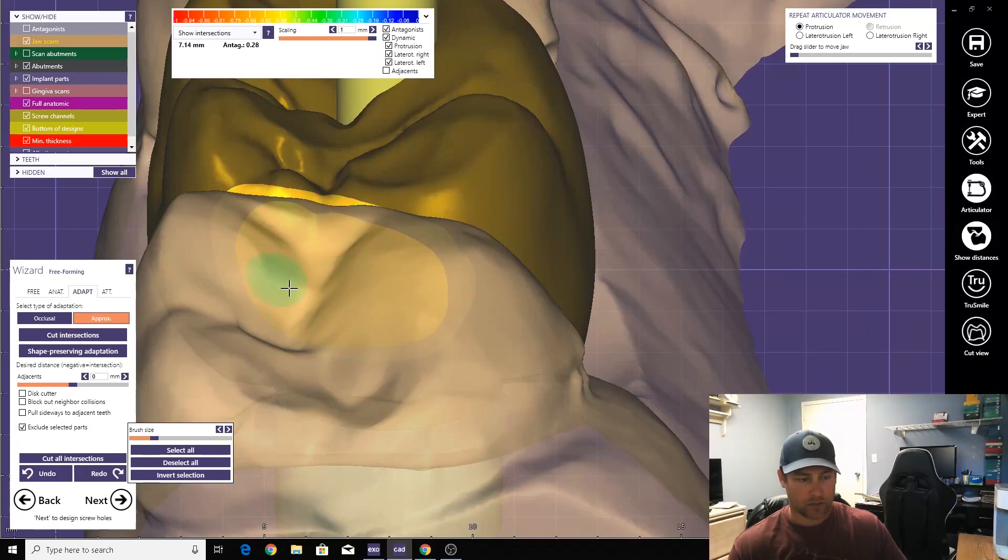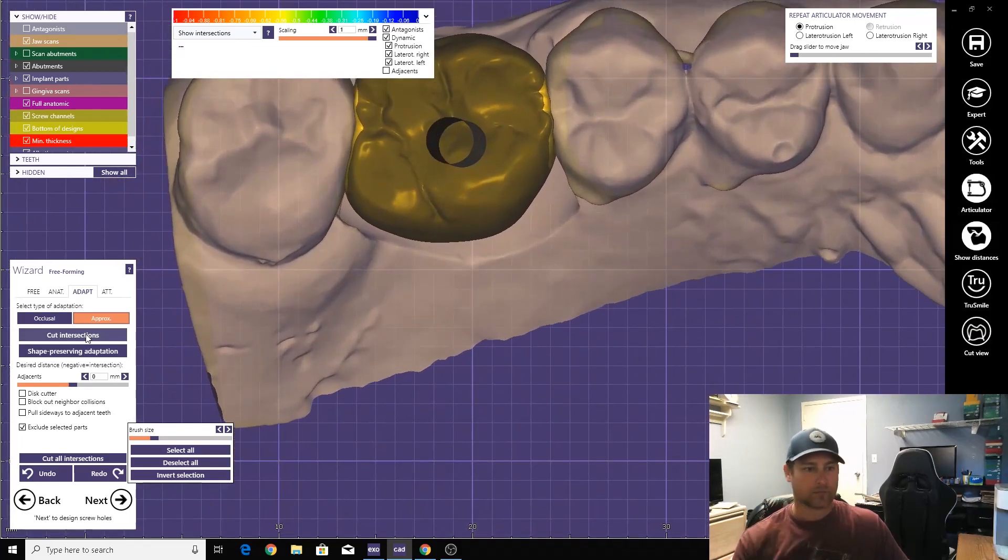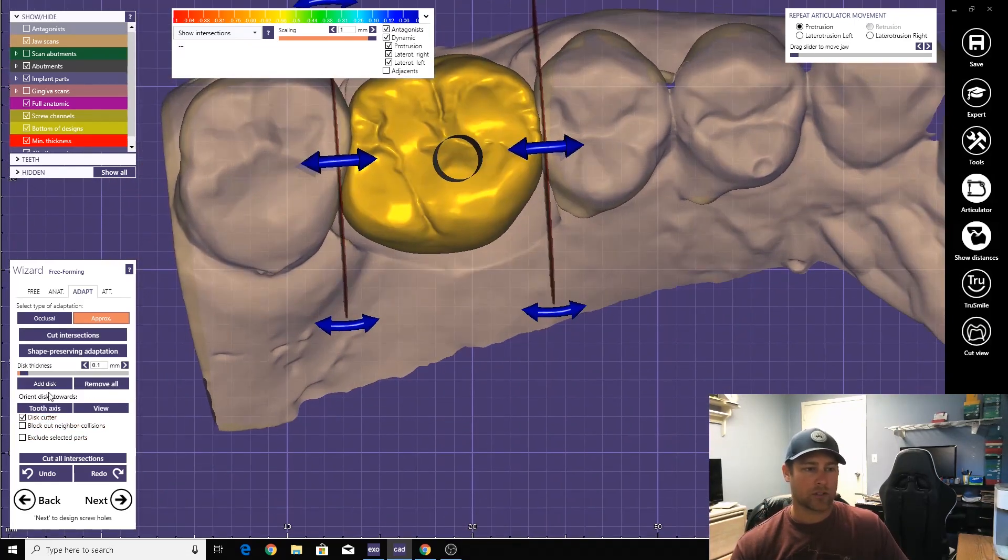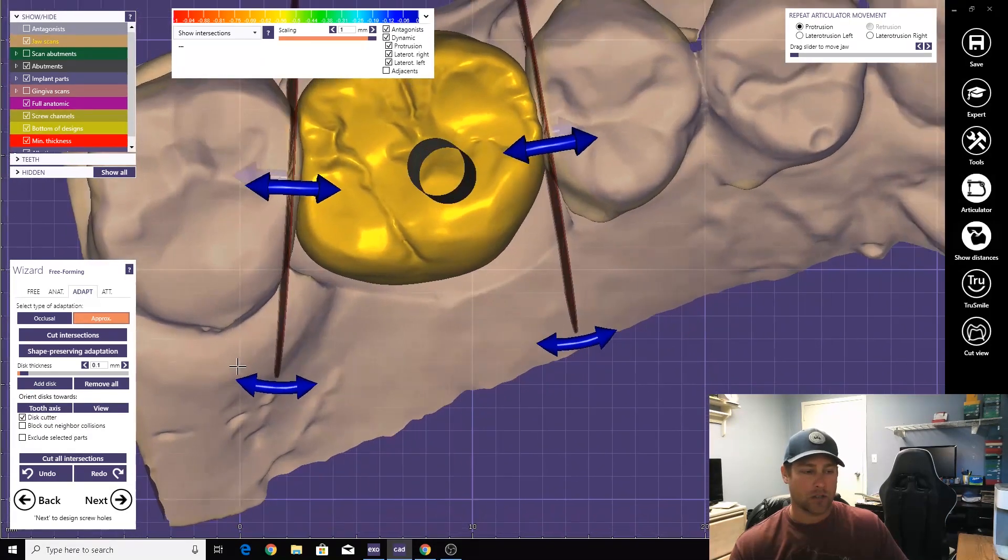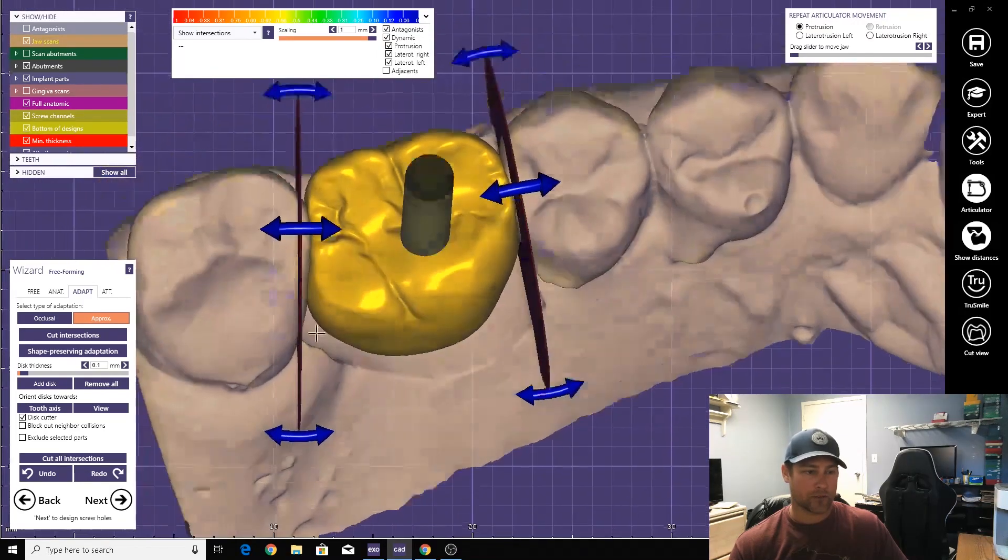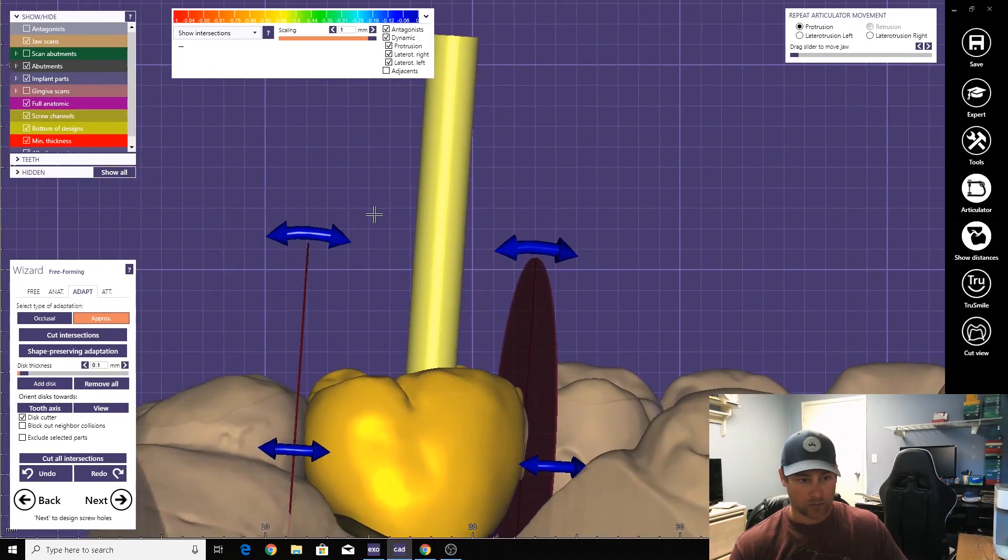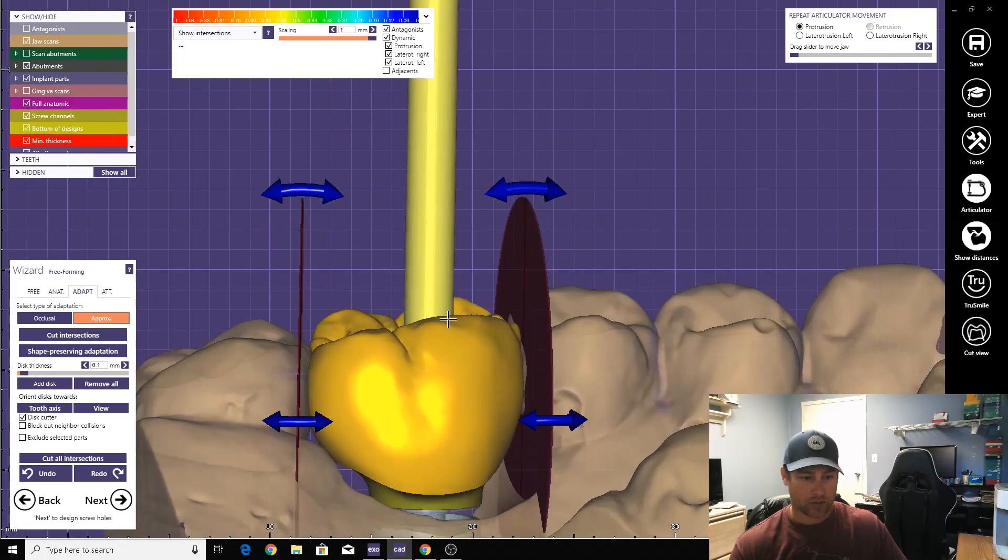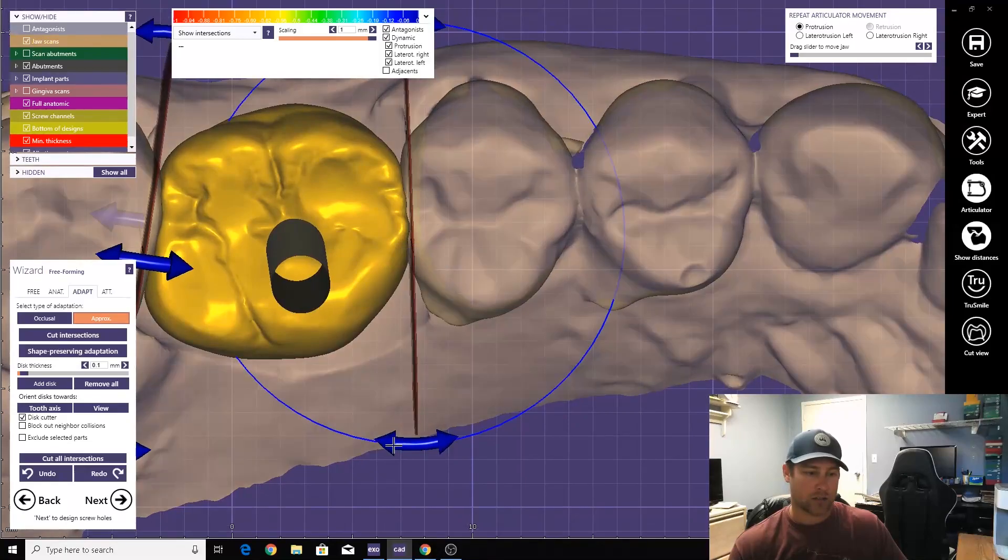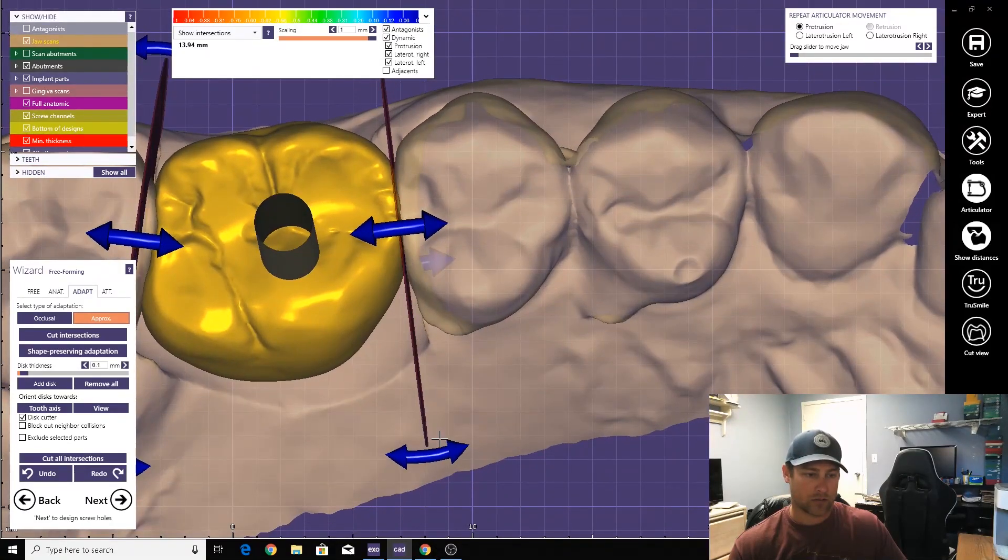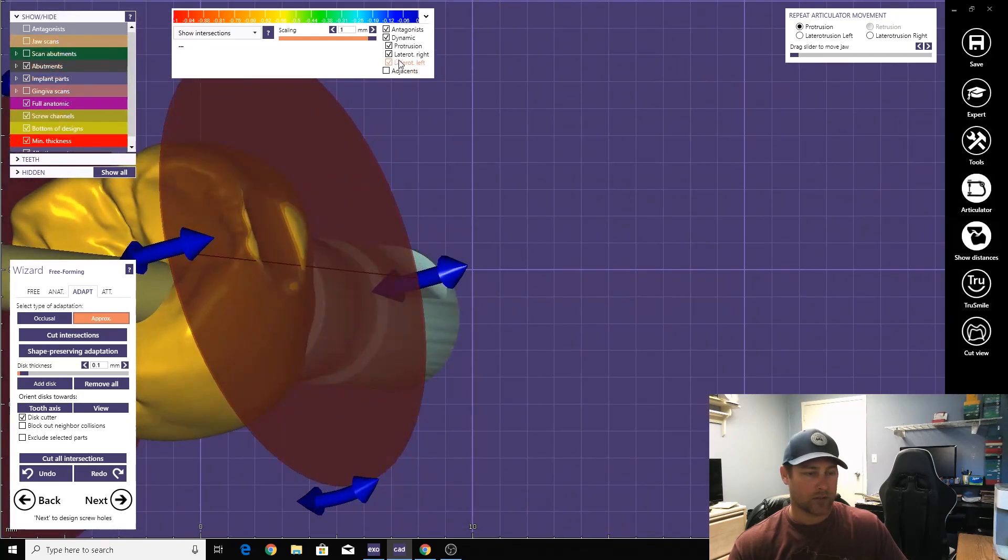Because there's only one way these things can go in. You can move these left and right up here from the occlusal load, but you cannot rotate them here, especially when you're in the screw-retained. Everything's lined up already with this screw channel, so you don't want to change that. Otherwise, the crown won't fit, contact will be too tight.